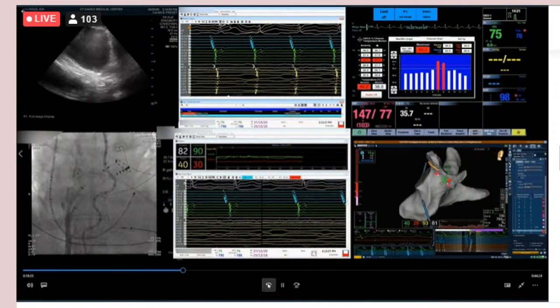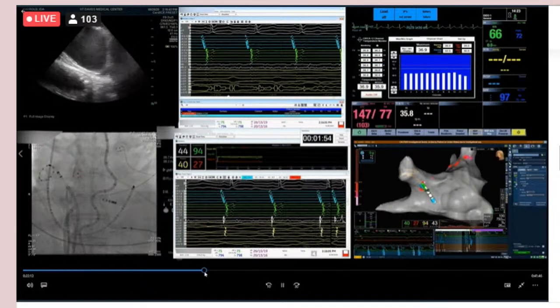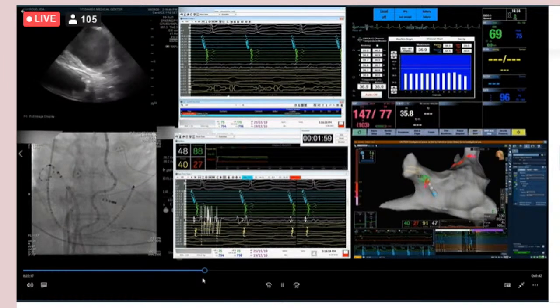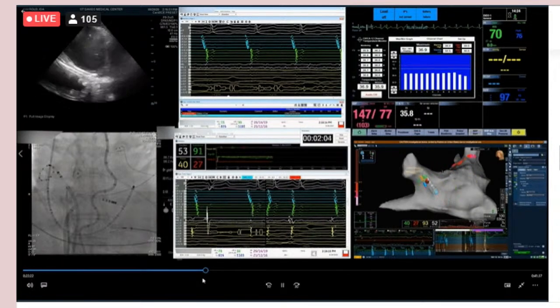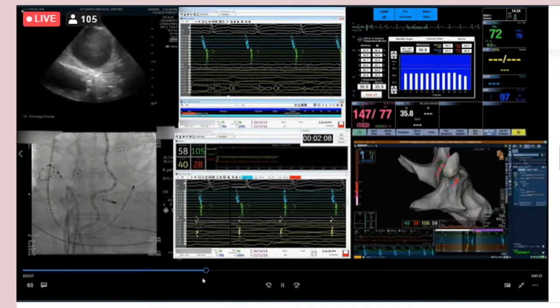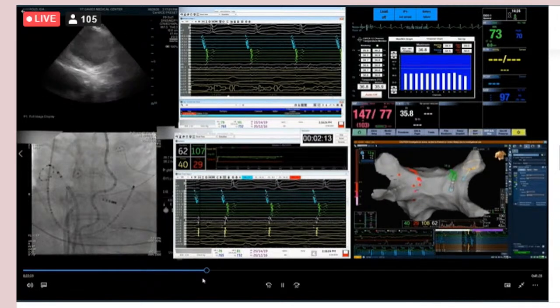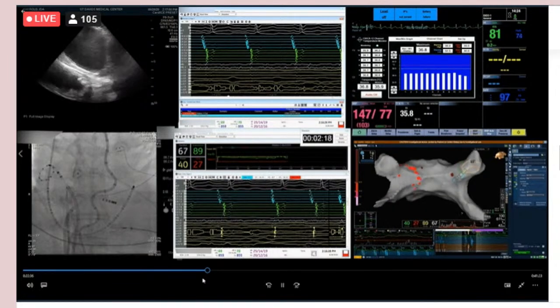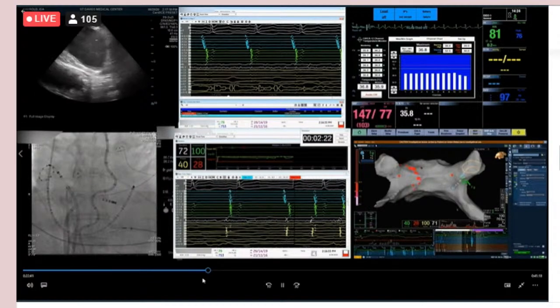Maybe fast forward to the right-sided veins. Okay, and then again, same kind of thing. You're able to really get the arrow directed nicely, so you can see that you're pushing up on the septal aspect of the right-sided veins, or the posterior aspect, wherever you happen to be, which I think is actually a really nice feature with it. And maybe fast forward a little bit there.